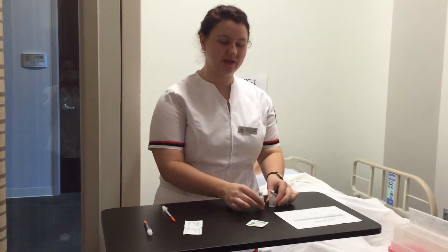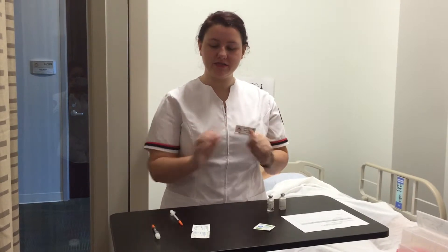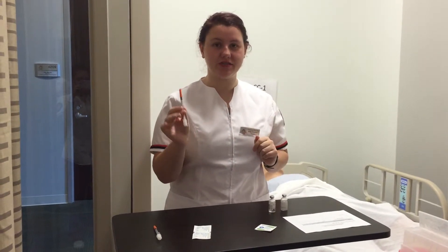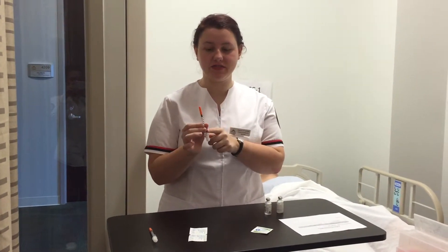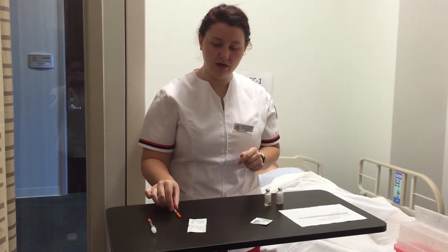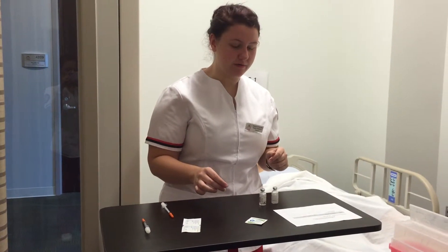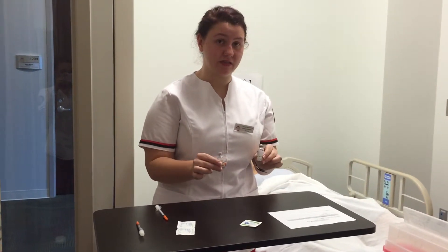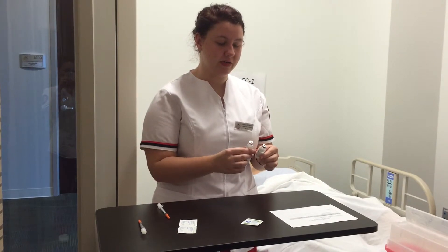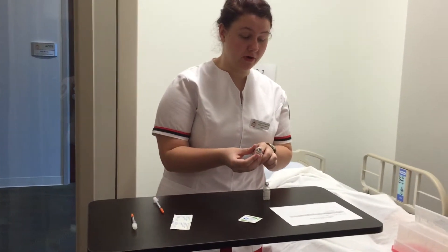I have gathered my correct medications. I would wash my hands. I have my correct syringe — it is an insulin syringe because it is in units and the needle is attached to it. I've selected the correct insulins, the NPH and the regular, and now I'm going to compare it with my MAR.